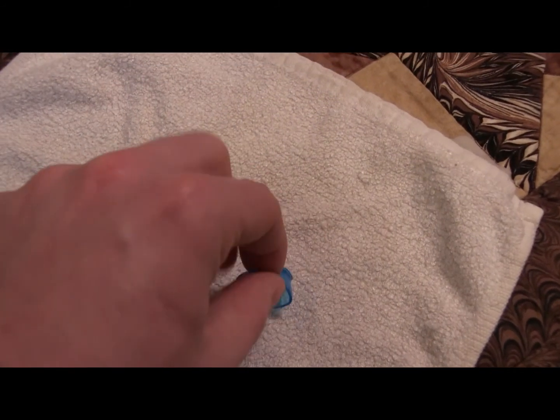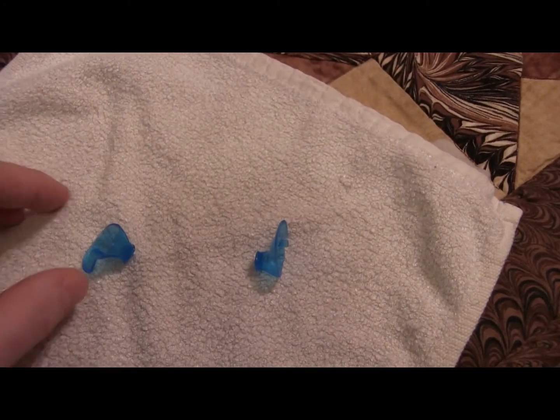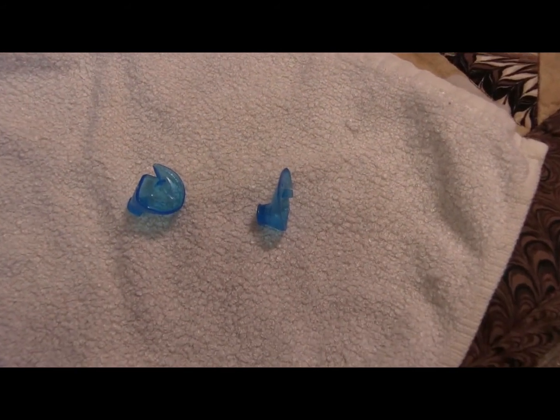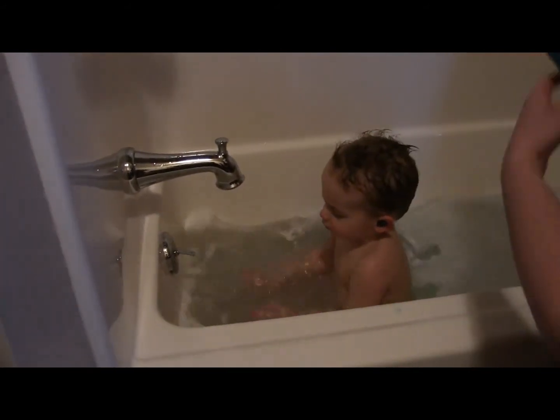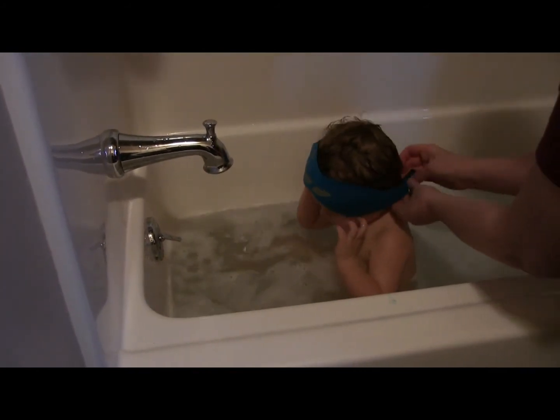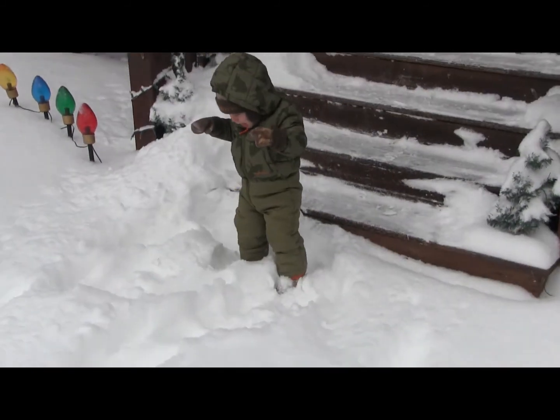With these earplugs, you need to ensure that you are putting the earplug in the side it is meant to be put in. Ensure that the earplug is fully seated to prevent leaks as well. If your child is pulling at his earplugs while he is in the bath, a headband may be used to ensure he doesn't pull them out. Covering your ears when outside in cold weather may also help prevent discomfort.